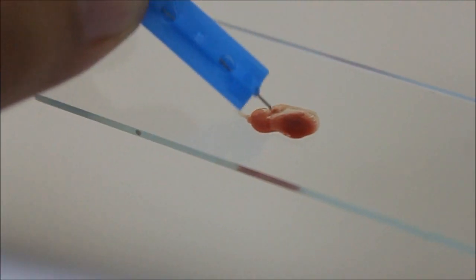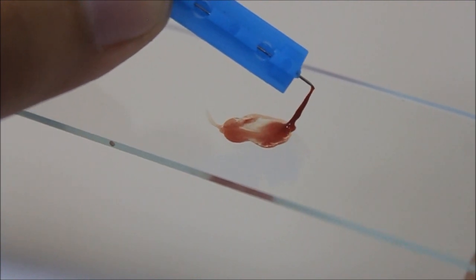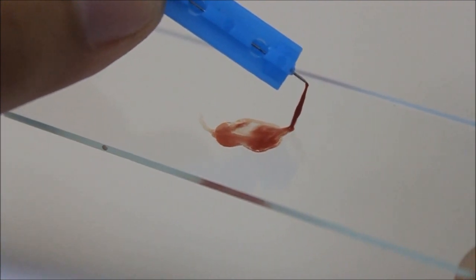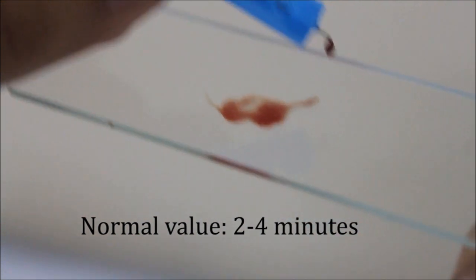Once this fibrin strand is noted, stop the timer. The time that elapses is taken as the clotting time. The normal value for the slide method is 2 to 4 minutes.